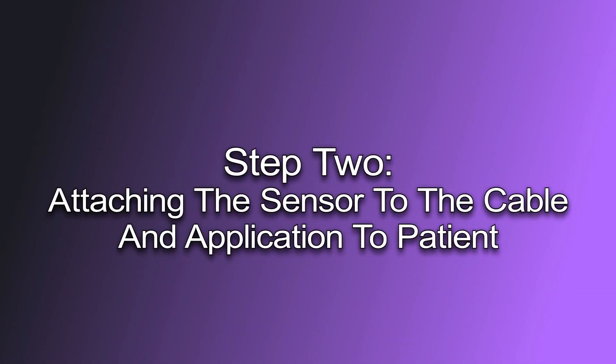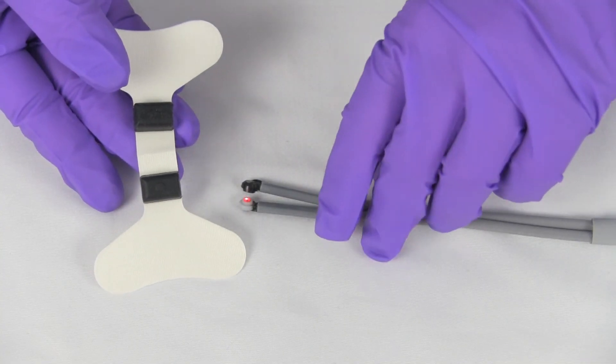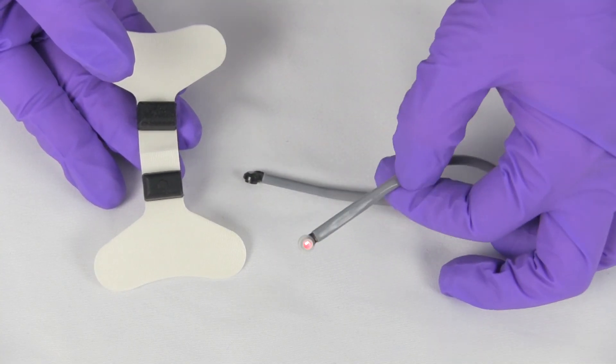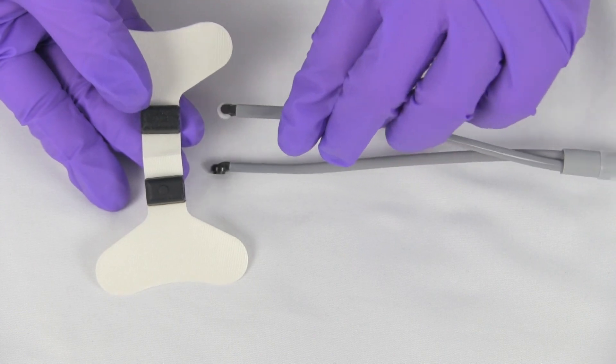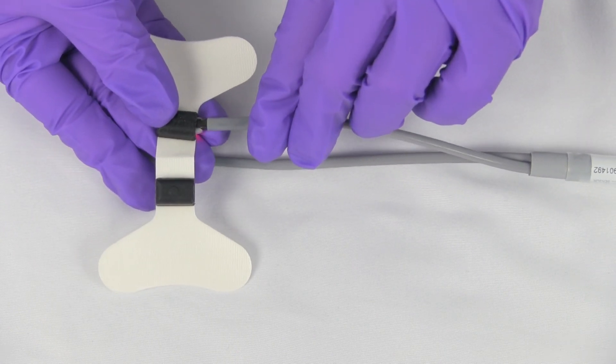Step 2: Attaching the sensor to the cable and application to the patient. To attach the grips to Iratomed's SpO2 OPOD, gently grip the fiber optic cable emitting the red light and insert into the opening on the selected grip marked by a star icon or number.